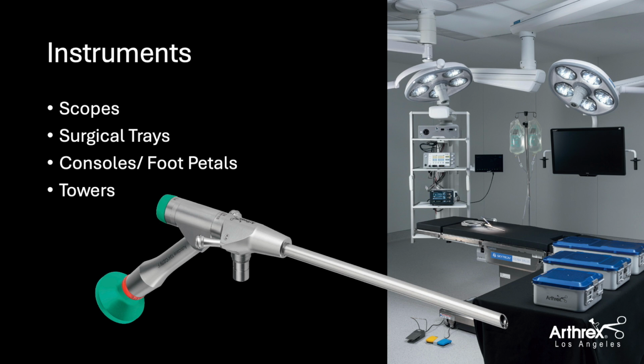It's important that you reference and go through each of the 3 levels that's in that tray so that you yourself have a good understanding of where in the tray it is, in which you're talking to a surgical scrub tech that you can actually visually see it, but also understand where they're going to see it, right hand, left hand, top, bottom, corner, middle, so they can find it accurately even if they've never done a case.